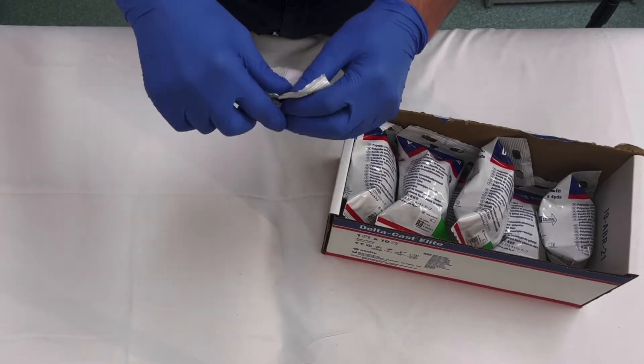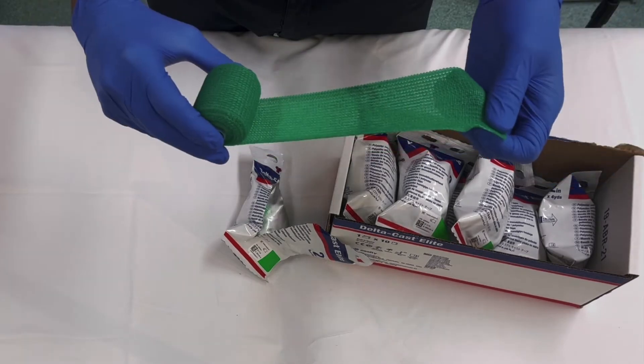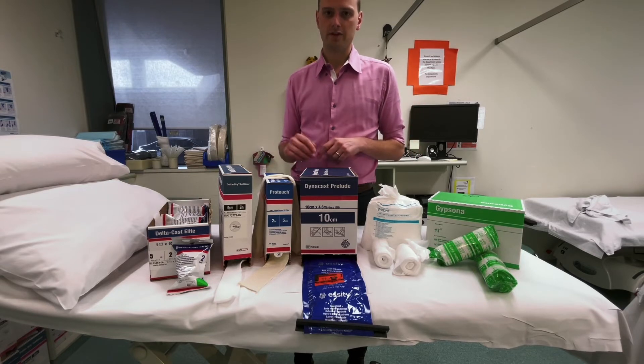The big difference when using synthetic cast material is that you must have gloves on. Whilst you can wash away most plaster except maybe around your fingernails, synthetic sticks like super glue and you have to wait days for it to come off. Definitely wear gloves and have a special set of scissors to cut it, because you can't tear it with your hands.